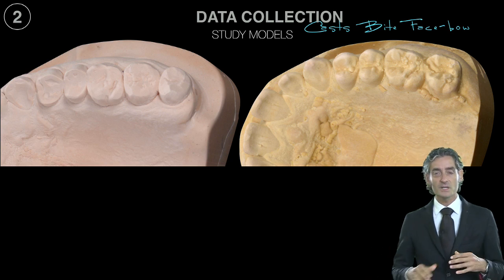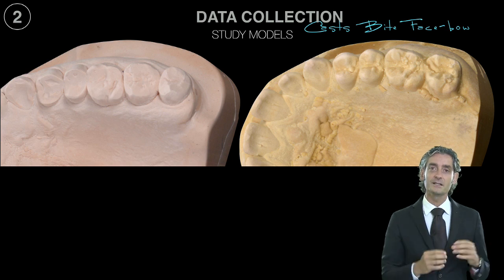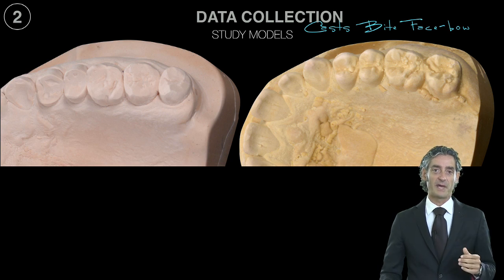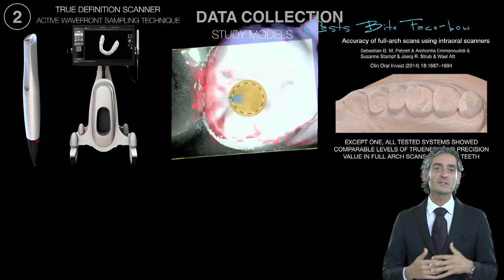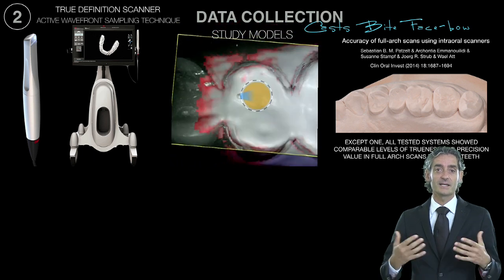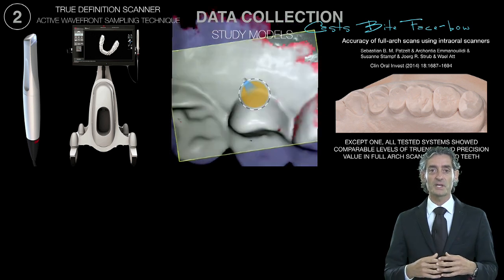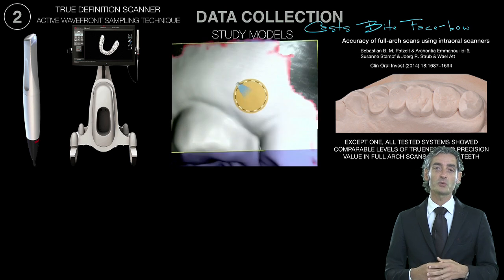And I don't know if you saw, but in my presentation in the beginning, in the circle, I put an asterisk, a red asterisk, because we have to collect the data also in the digital path. And so when we consider the digital path, right now we can start with an intraoral scanner in the way to take impressions. For us, it's a technology that is starting to become common. And we can take a nice impression right now with the latest devices that we can find on the market.